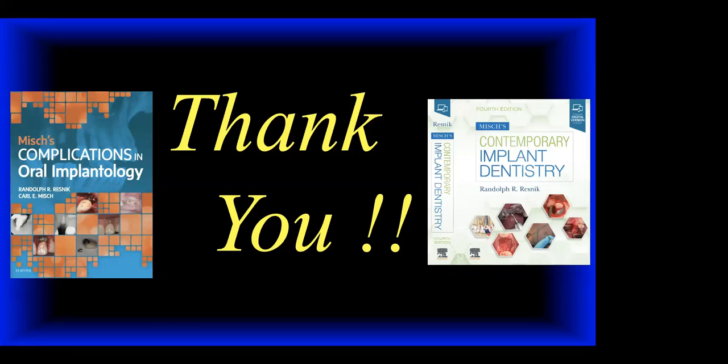Thank you, Dr. Resnik. One final question. Yes. We did get many questions regarding zygomatic implants. Would you ever consider zygomatic implants to avoid sinus augmentation?